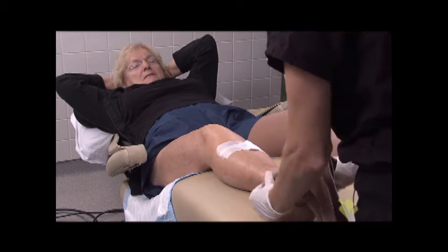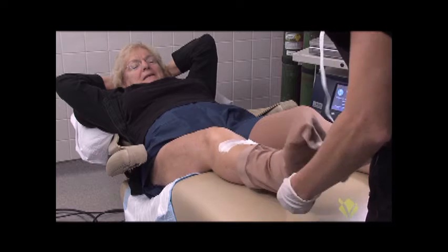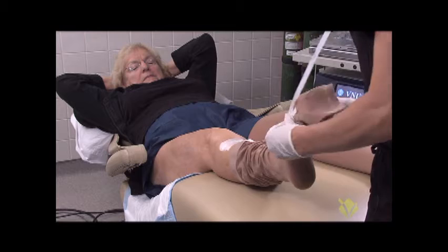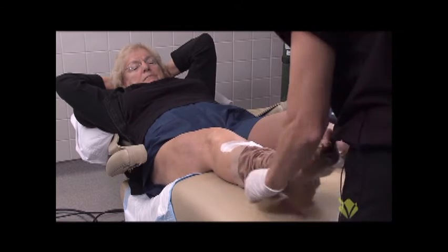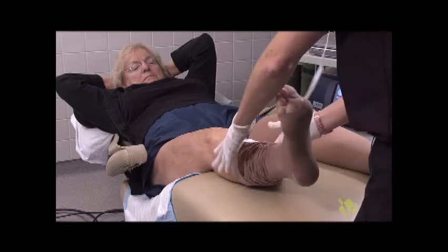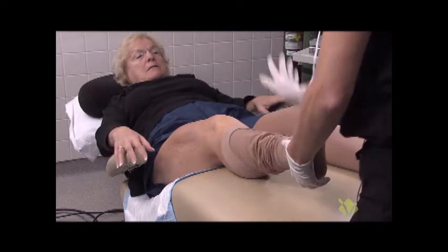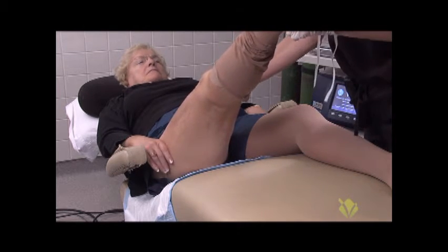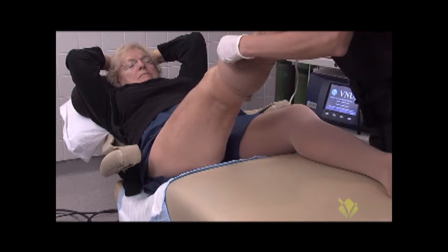This compression stocking — this is the fun part. I always like to keep my gloves on because I find it's much easier; the gloves really do help. We put the compression stocking on, and then the patient — you're to keep this compression stocking on tonight. It's really important that you relax; we don't want to put any extra pressure on this vein that we recently closed, so this is my job today.